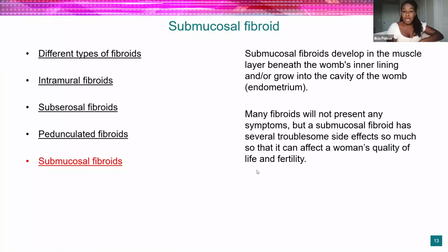So with submucosal fibroids, since they are distorting that endometrial lining, that's the lining that sheds every month for your period, and of course where the embryo will plant itself once you're conceived. So sometimes the submucosal fibroids will either push on that lining, or like I was saying in the beginning, like I call it intracavitary, can be right inside that lining. Now, if you have something in that lining, it just causes a tremendous amount of bleeding. And of course, if you're trying to get pregnant and there's something already there blocking it, it can cause some women to have recurrent miscarriages.